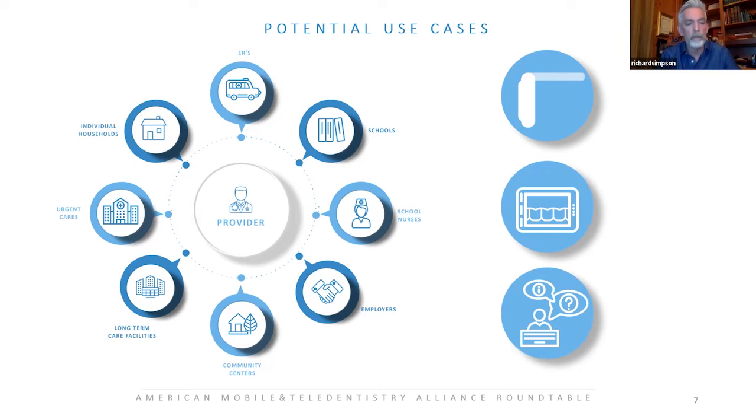And in one area we've got in Northeast Alabama, we have a group of 5 pediatric practices now that have TelScopes. Every specialist that they refer to is 1, 2, 3 counties away. So now they're able to send images to ENTs to get assessments for tonsils, to see if they need to be assessed to have tonsils removed without the parent having to take a day off of work and drive 2 hours to get an initial exam. They're able to refer to their pediatric dentists that are 1 or 2 counties away to do an initial assessment, particularly since the pediatricians are well aware of some of the cases that may be having to go to the hospital.